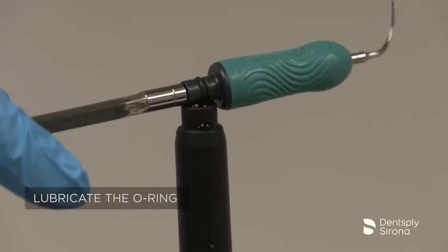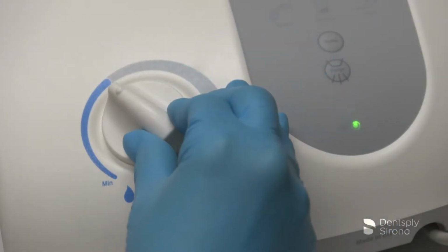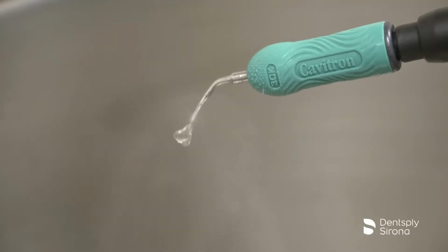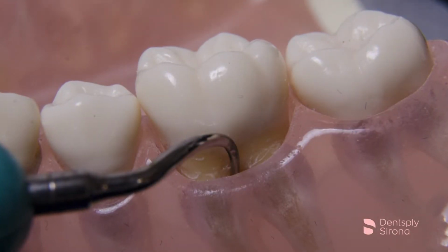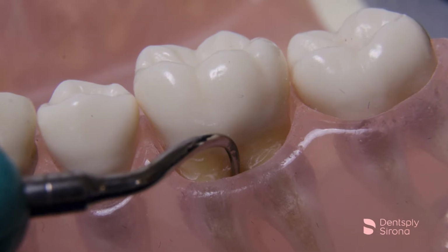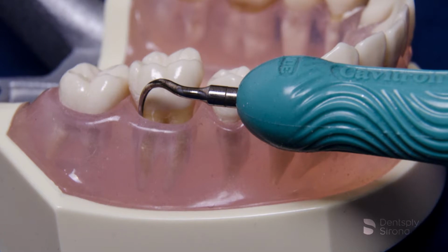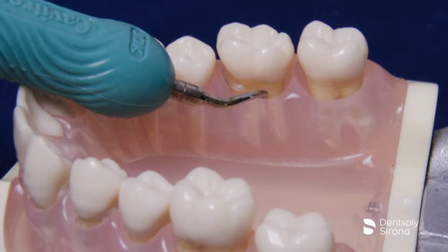After the clinician has filled the handpiece with water, seated the insert, selected the power, and adjusted the spray properly, instrumentation begins according to the treatment plan prescribed for the patient. When access is indicated in deeper pockets, in particular the posterior teeth, the curved insert is often necessary to maintain true adaptation of the terminal 2 to 3 millimeters at all times.